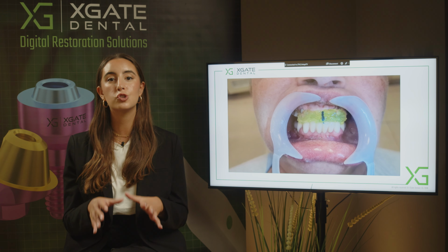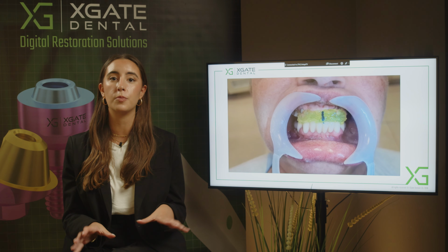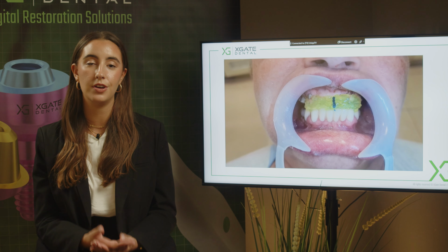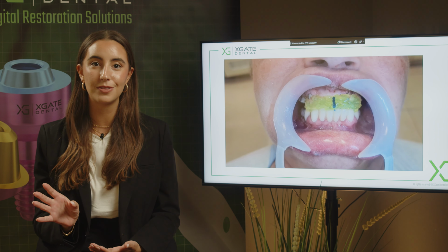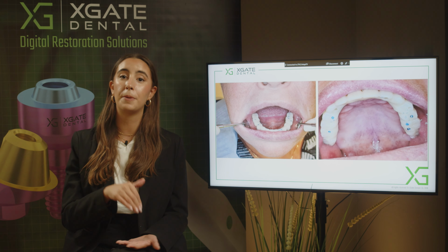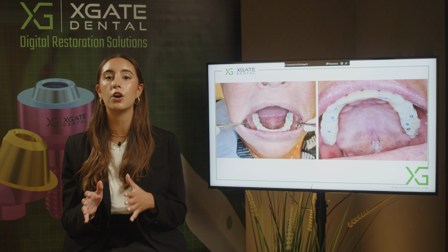And we'll have the full jaw with all of the scan abutments, and it will be in relation to the lower jaw according to what we built with the composite material. The most interesting and amazing part that you can see is that you have contact points in all of the places. So you know that when the patient closes her mouth, you have a pretty good occlusion.